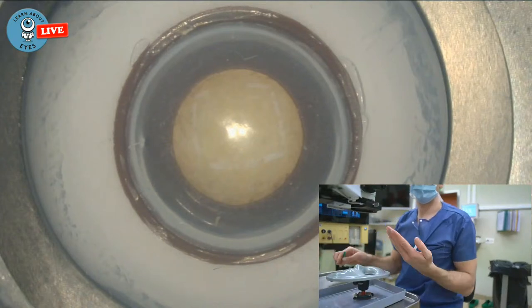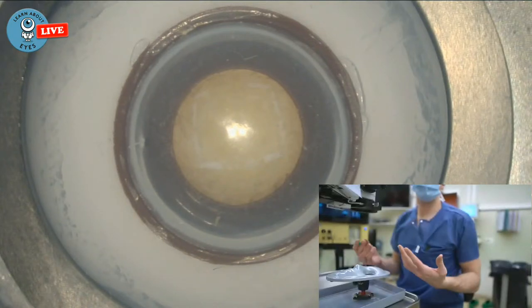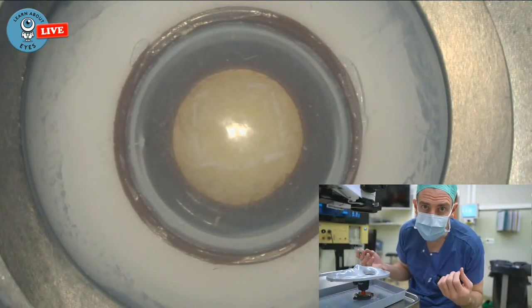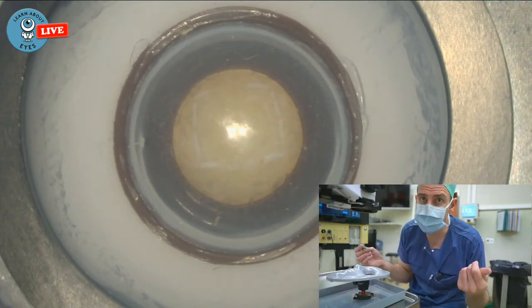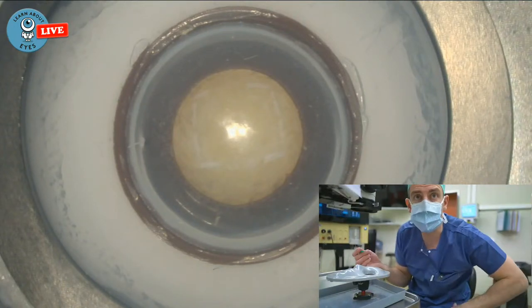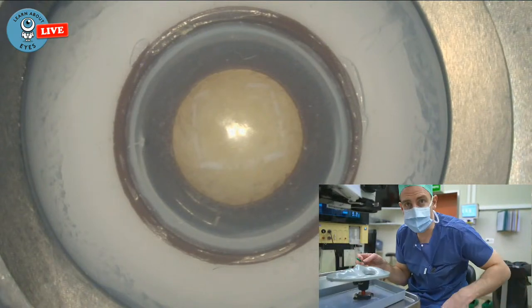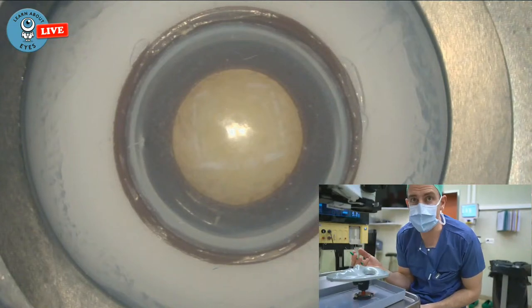So, by the way, I would usually recommend using gloves so it feels as realistic as possible. Just don't use the expensive sterile gloves, just use some normal gloves. But since I'm going to be using the touch screen a lot, I think I'm not going to use gloves today.